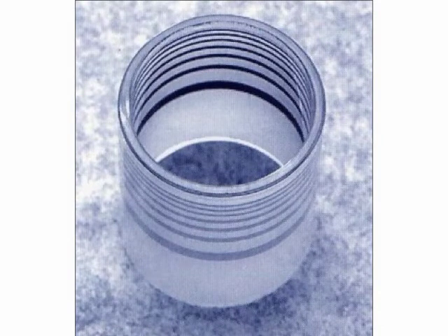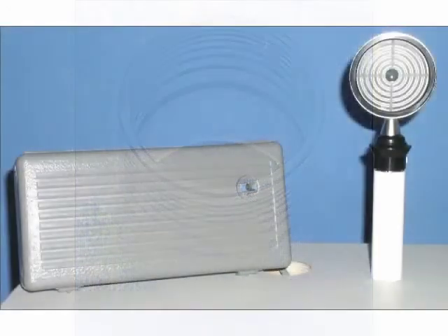It is a clear piece of plastic with some bands of black and white on the inside that we illuminate from the side with a slit lamp beam, and we'll cast rings onto the patient's cornea. And indeed, when I started as an attending, I made the residents all buy these little rings. They're about $20 each, and they are very nice. They're regrettably fragile, but they are very nice.